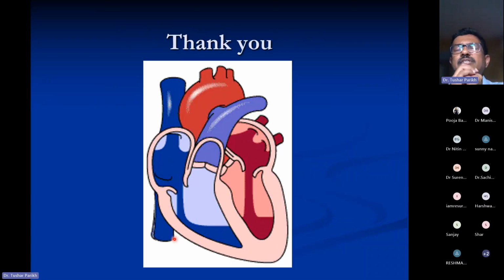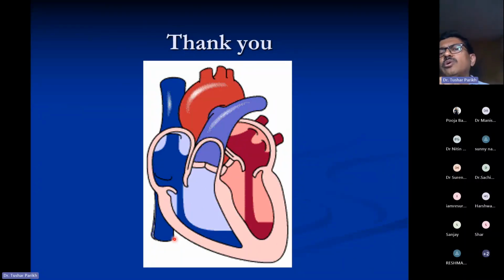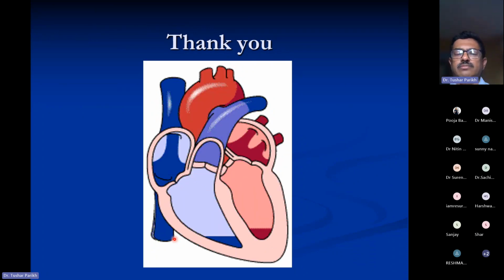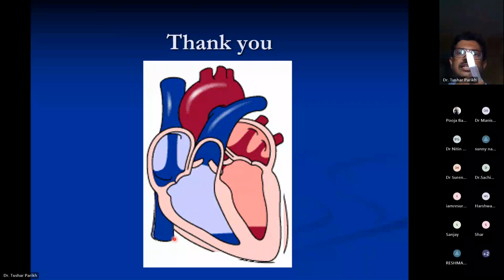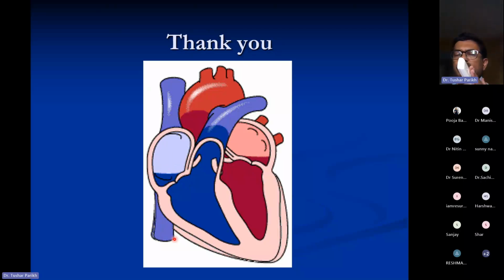So again, this completes my assessment of PDA. Summarizing my talk, the PDA can be a normal structure in the first 3 days. So how to look for the PDA? Put the echo probe in the high left parasternal area, long axis, facing 11 o'clock, 12 o'clock. Tilt the probe a little bit to the right side so that it will cut through the PDA. The PDA is seen as a cephalad continuation of the main pulmonary artery.